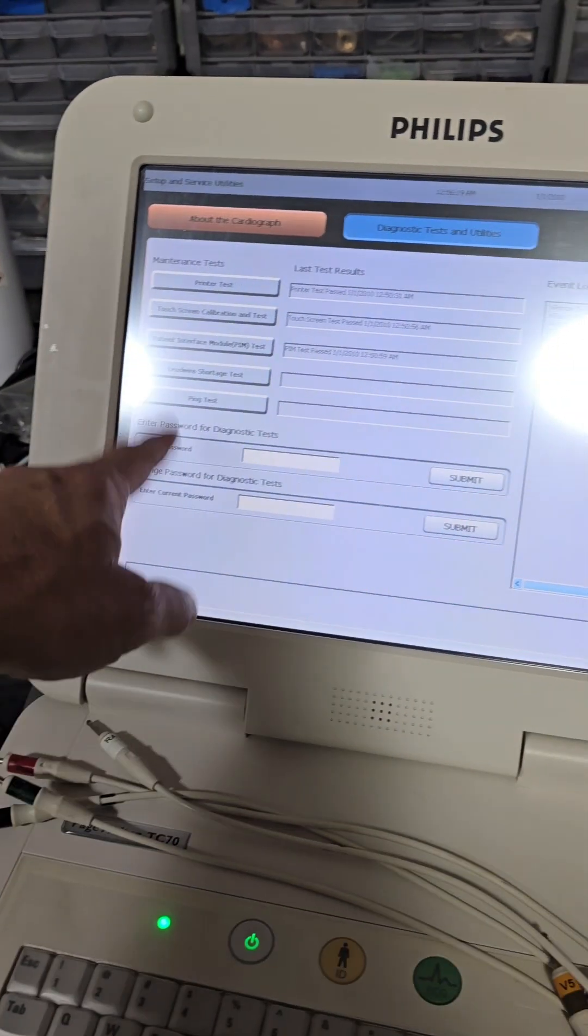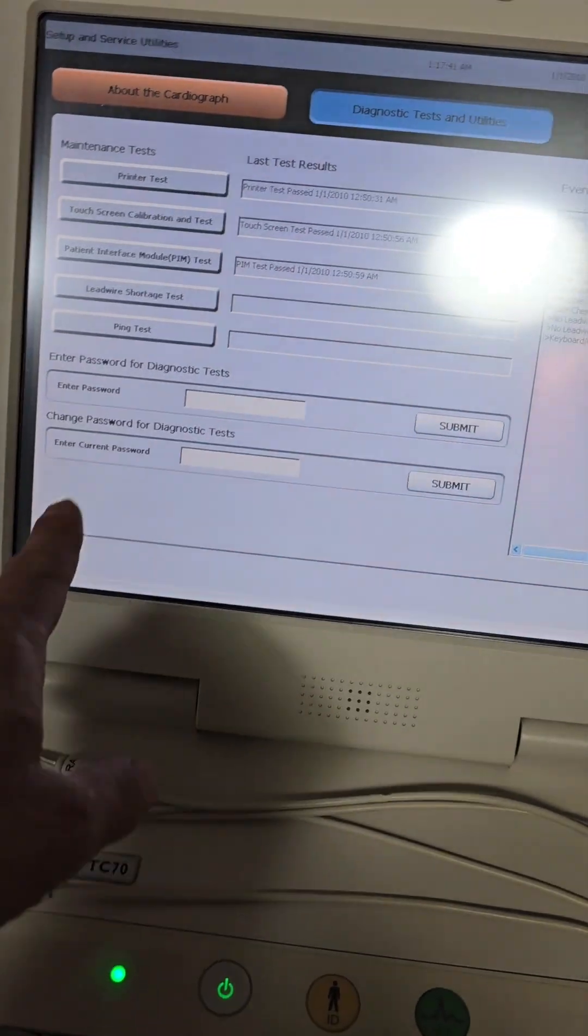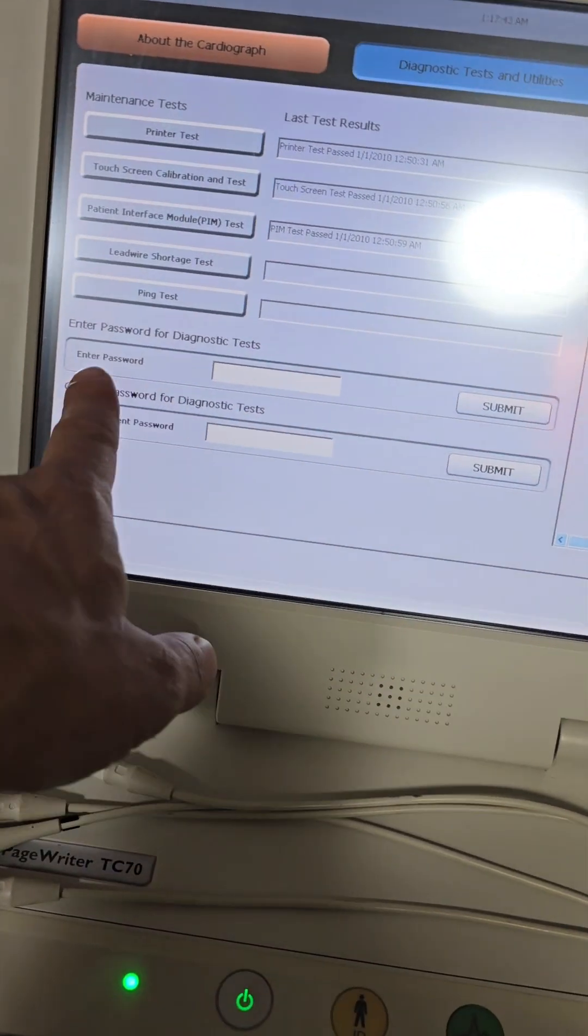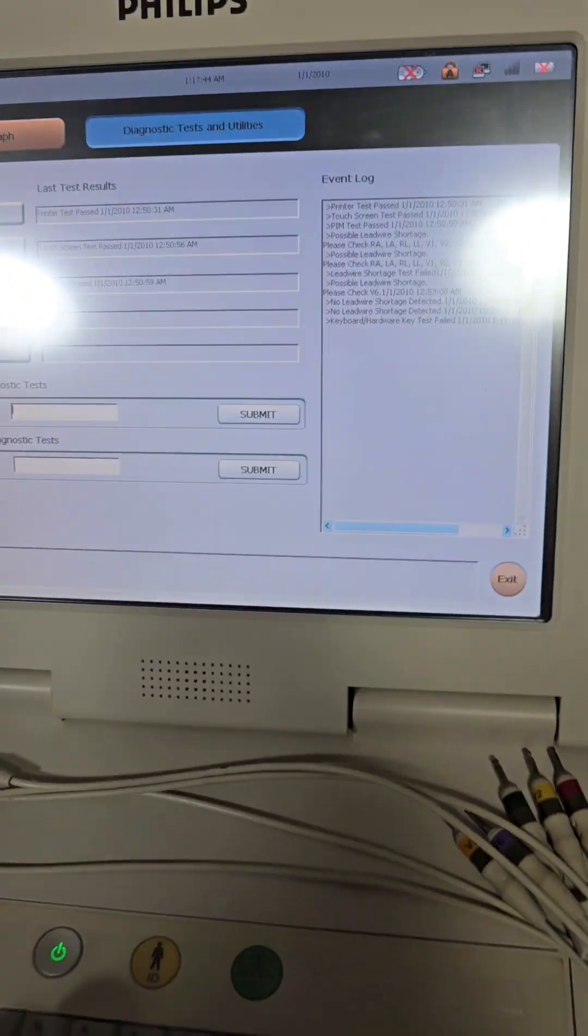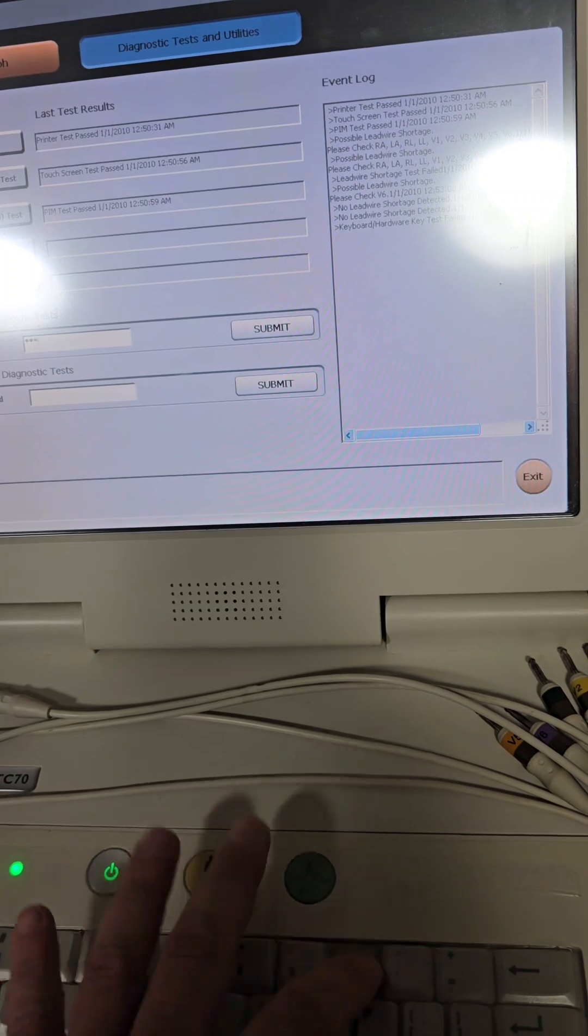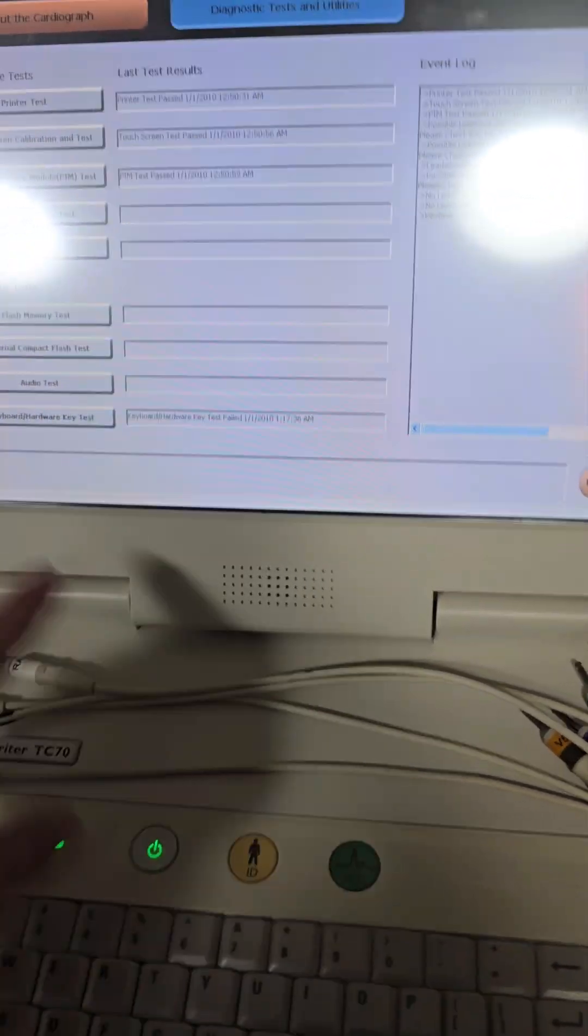Now, there's some extra tests here. Alright, so the last thing here is the diagnostic tests. Password is just zero, six times. One, two, three. One, two, three. Boom.